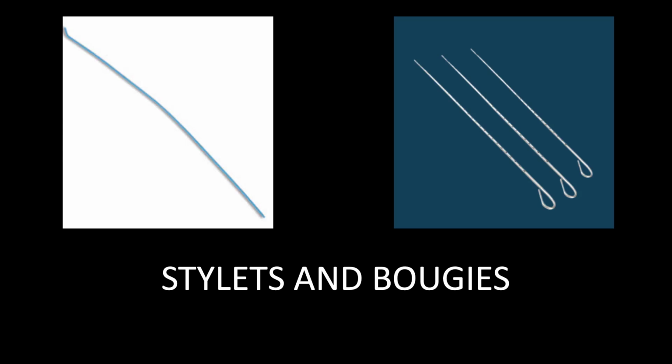Using a bougie allows you to maintain visualization of the laryngeal inlet during your intubation attempt. It allows you to confirm placement with looking for things like distal holdup and feeling for tracheal rings. And thankfully there is some new literature coming out from emergency department data which shows greater first pass success rates. But Jake and I would definitely advocate that people use bougies on all their first attempts at laryngoscopy.